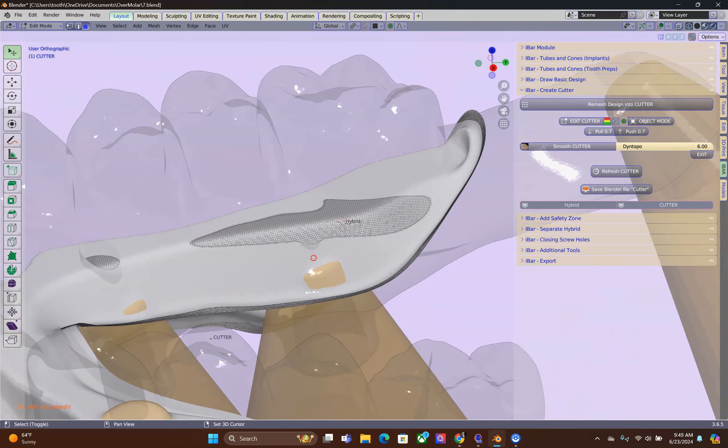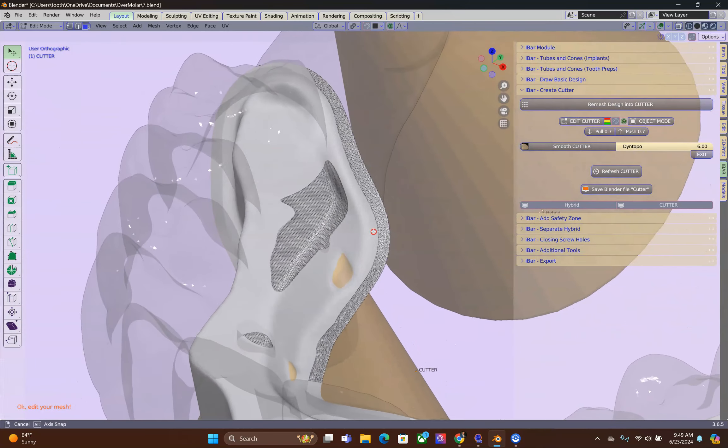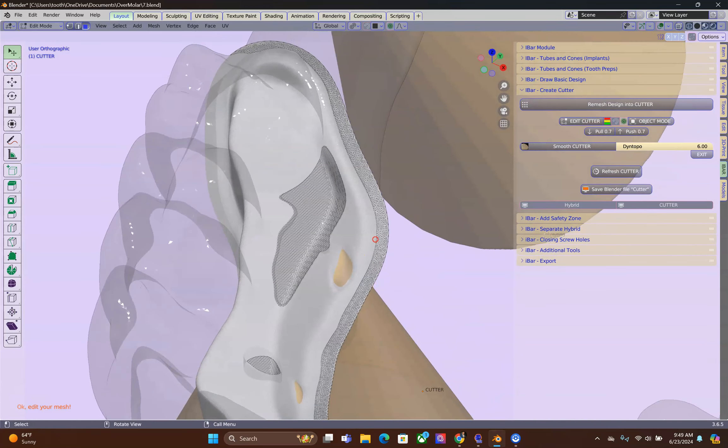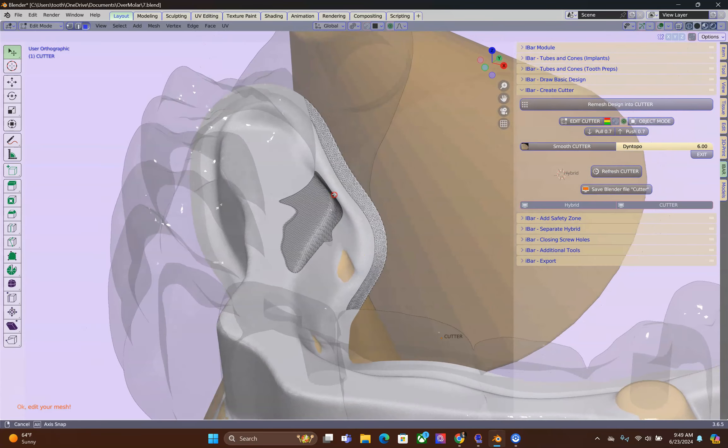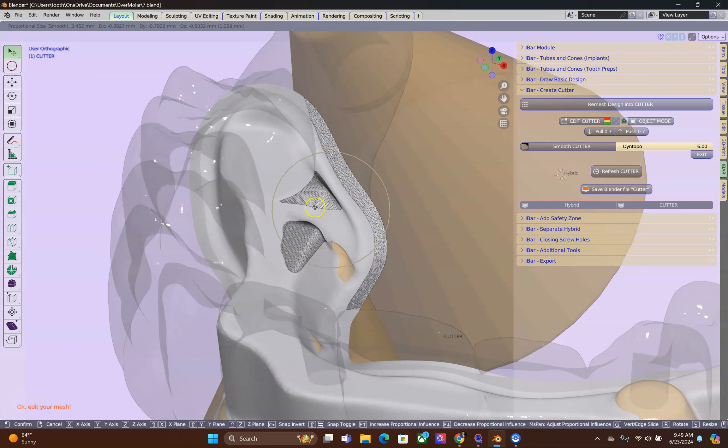Select the vertices. Rotate your scene. Then use your G key to grab, with proportional editing, a whole bunch of vertices inside of your hybrid.